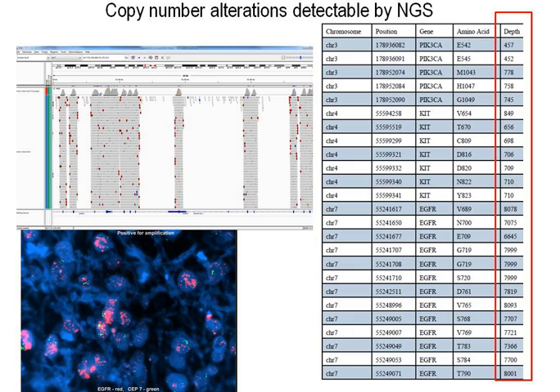And as you know, just by the number of reads you can get, one can easily look at the major amplifications. So shown here is an example of EGFR amplification, where if you look at the coverage, the coverage suddenly goes from 800 to 1,000 to 8,000, and you can see these obvious amplifications by NGS, but the smaller ones and the less copy number ones are not very easy.